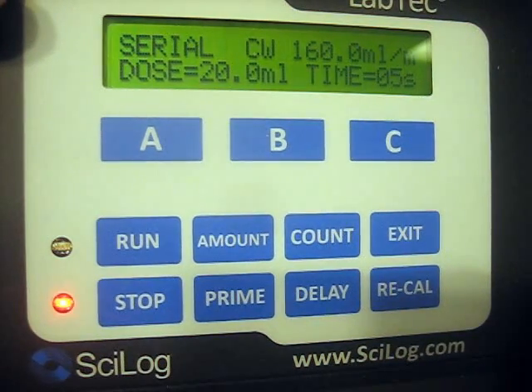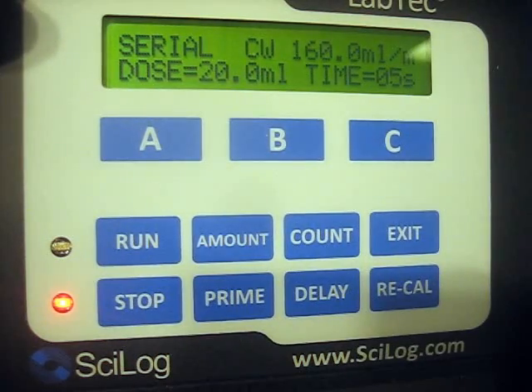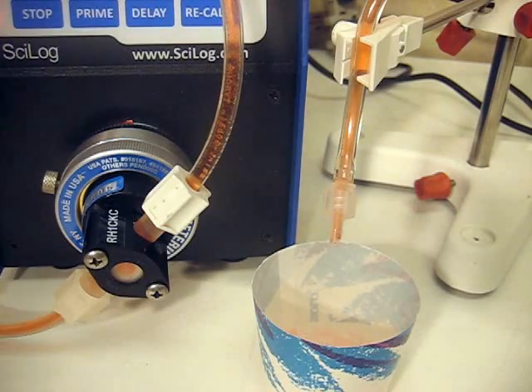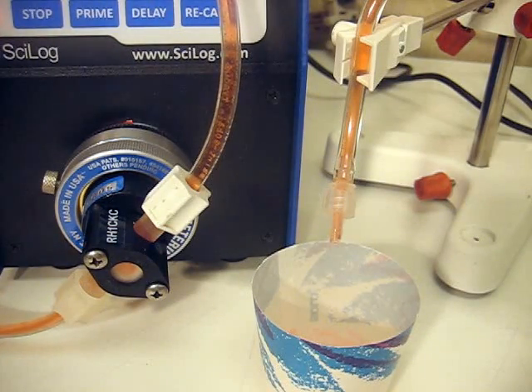The screen now shows that we did 200 milligrams or 20 milliliters. I now want to show you how it looks with a close-up at the dispensing tip when doing 100 milligrams or 10 milliliters.